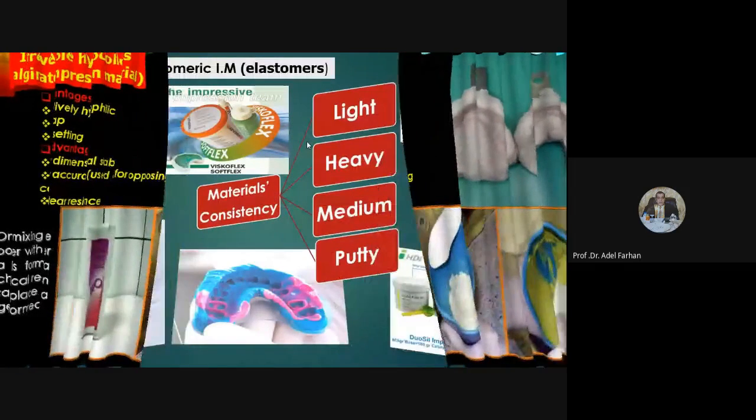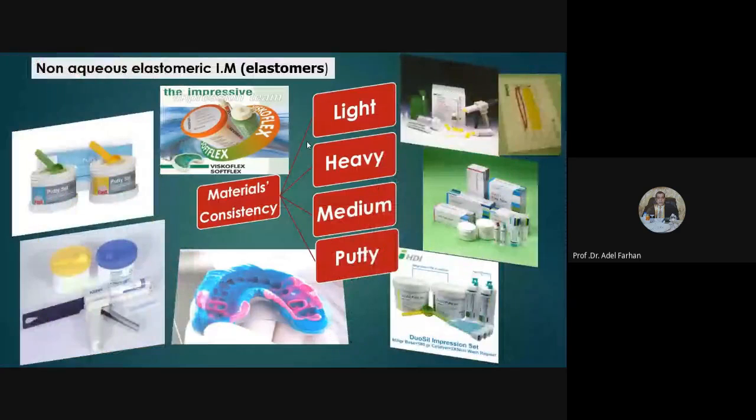النوع الآخر من الماتيريال عندنا هو الاستومر ماتيريال اللي هي الاستيك. طبعا this material اللي هي الاستيك impression material تجينا in different consistency. طبعا الماتيريال هذه set by chemical reaction via catalyst and base و usually supply in different consistency ranging from the light to the putty.